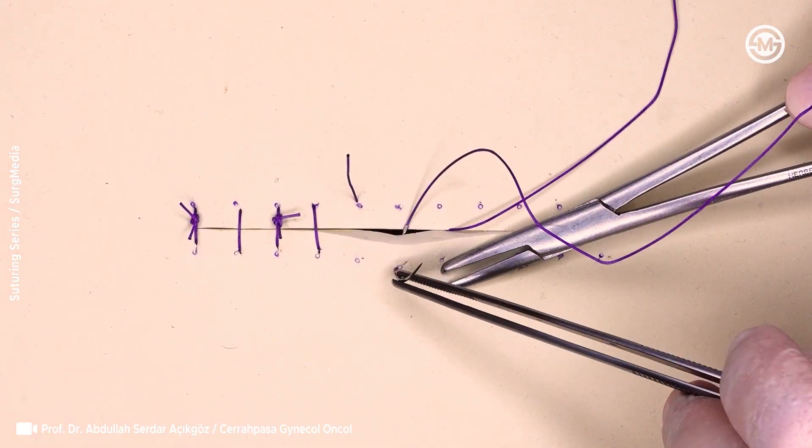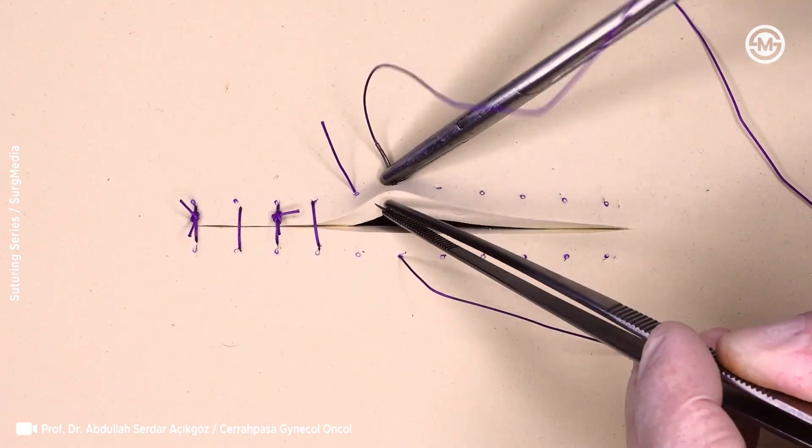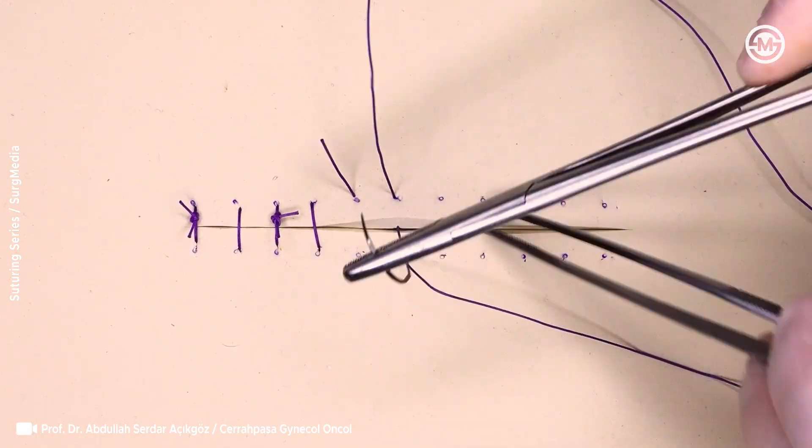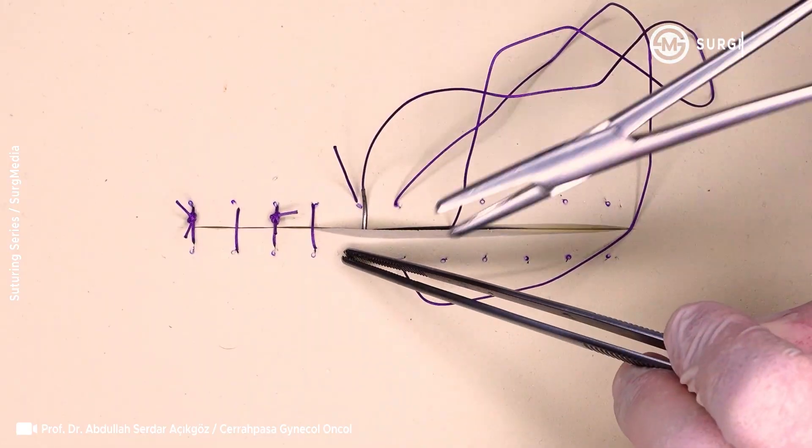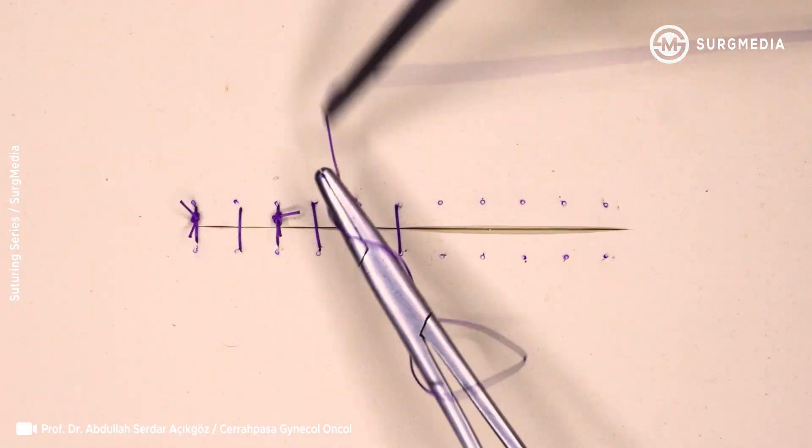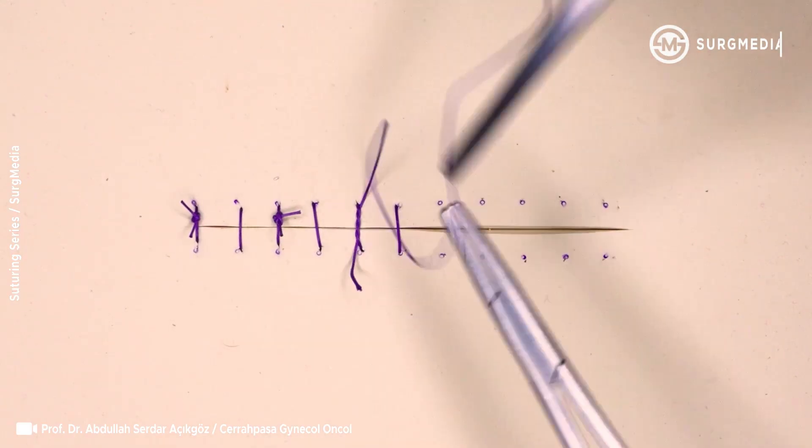Unlike a standard horizontal mattress suture, which depends on good tissue support between entry and exit points, the inverse figure of eight works especially well for closing small circular defects, like those from punch biopsies or for closing defects in fragile, friable tissue.